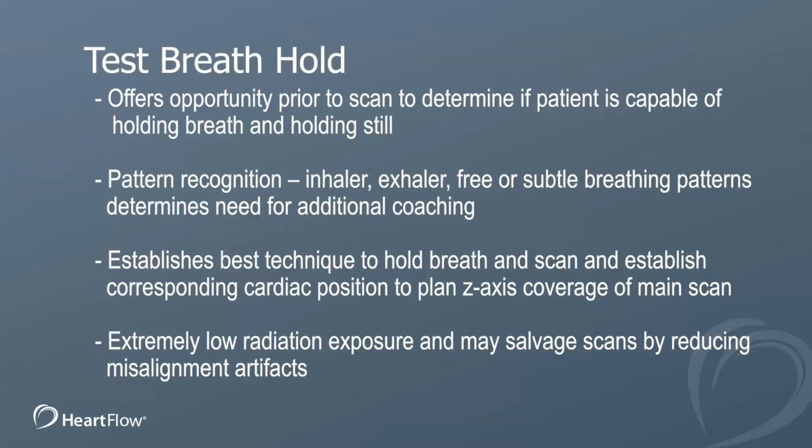Test breath hold imaging is something we use at our facilities to minimize motion artifacts during the scan. This offers an opportunity for you to actually image and see whether the patient is capable of holding their breath with very little radiation exposure. There are pattern recognitions you can see when you do this. There are some patients that are incapable of holding their breath on inhalation or exhalation, and you can use this information to help determine which breath hold technique is best.